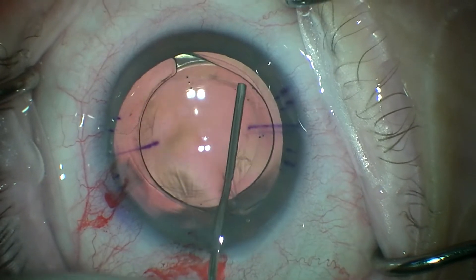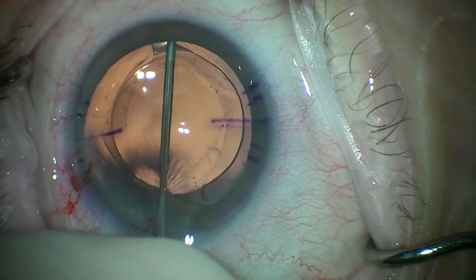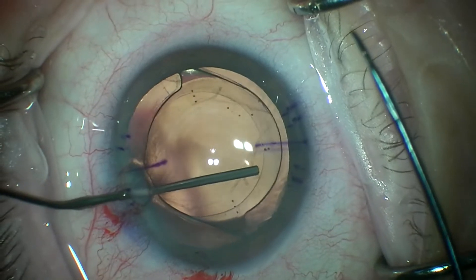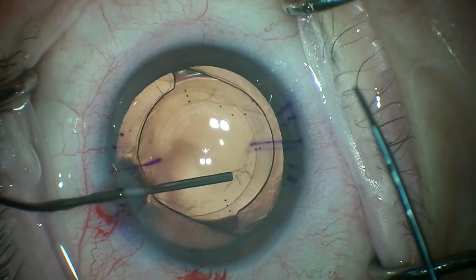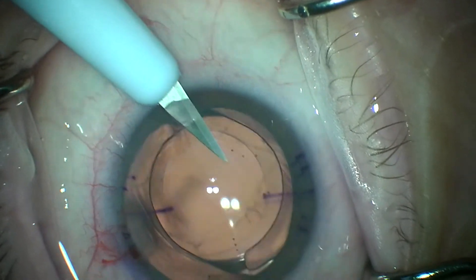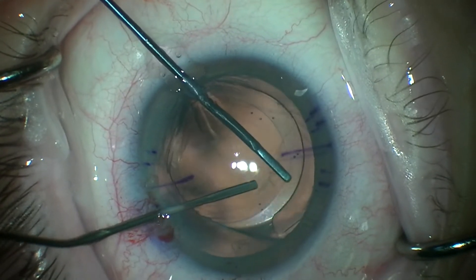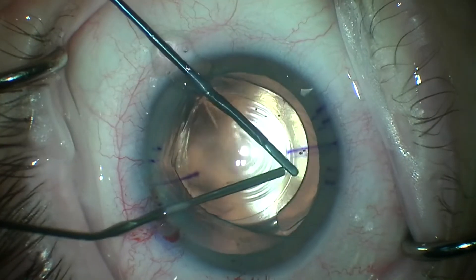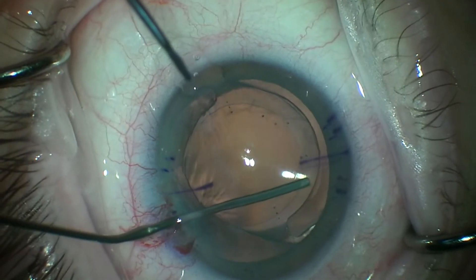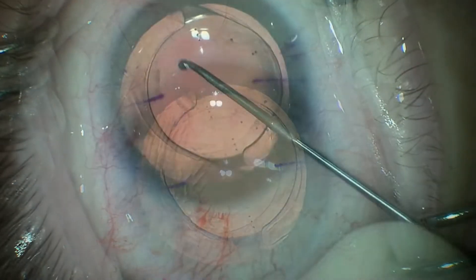We're post-YAG, non-vitrectomized eye. We'll do some vitrectomy later, but we're just going to try to work some viscoelastic. I couldn't quite get underneath the edge of the capsule at the bottom of the screen, so I'm going to do a two-handed technique to lift up on the edge of the capsule and then slip underneath with the viscote cannula — and you can see some viscoelastic going around.